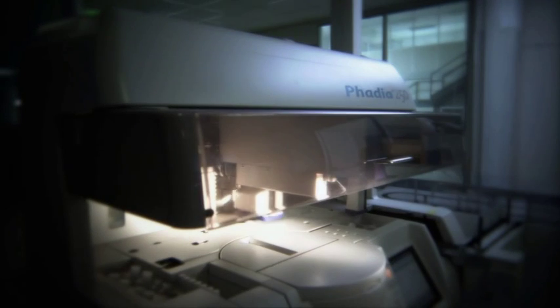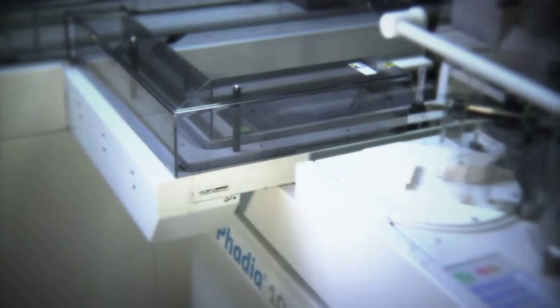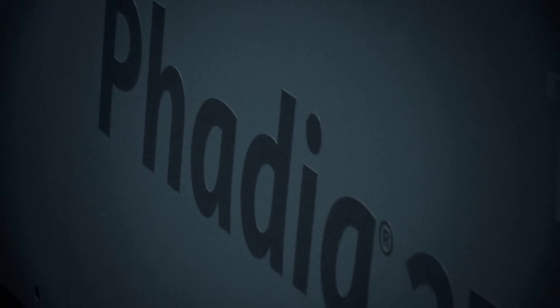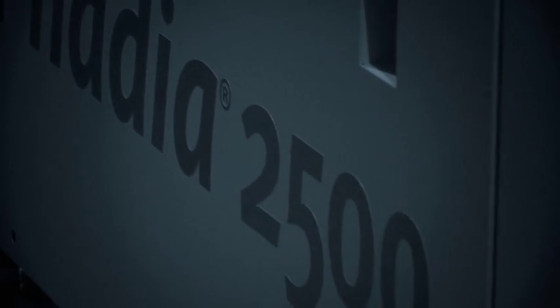From the global leader in allergy and autoimmunity diagnostics, the creators of Phadia 100, Phadia 250, and Phadia 1000, comes the next generation of laboratory systems: Phadia 2500 and Phadia 5000, unmatched efficiency for large clinical laboratories.